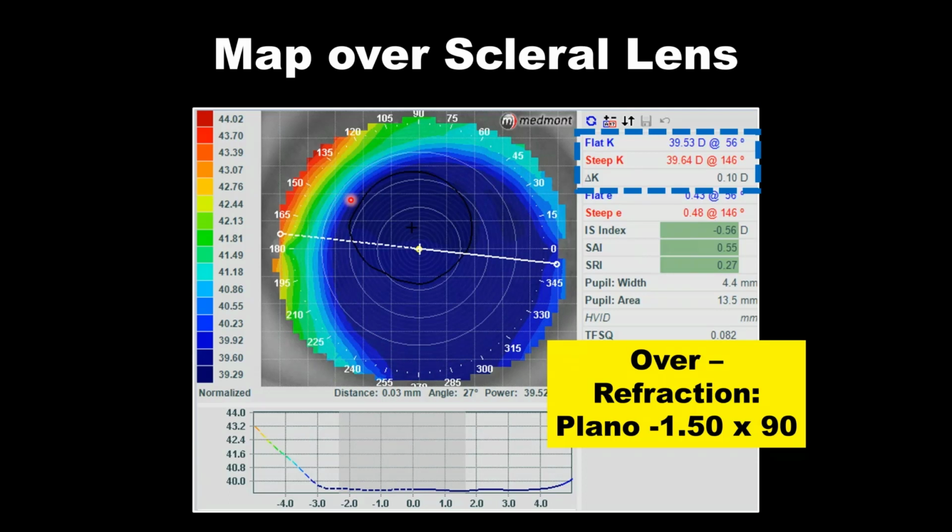So for this patient, we need the front toric. A thicker lens is not going to cut it. We have to verify that the lens we're using has a toric periphery, that it's rotationally stable, and we can add the front toric optics to this lens.